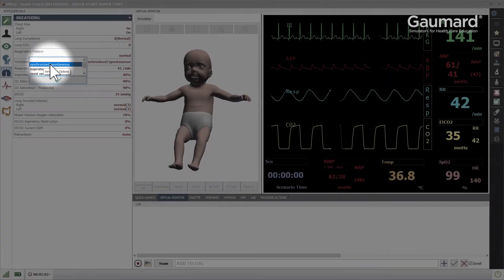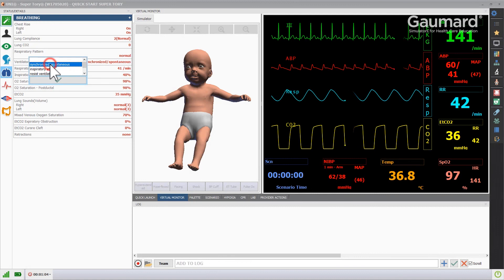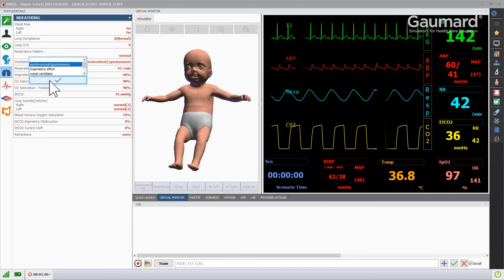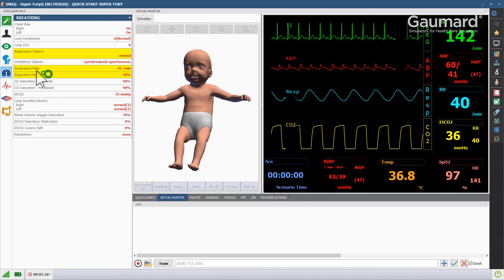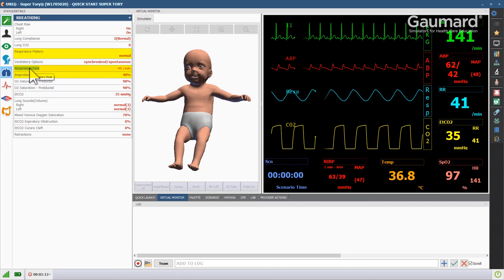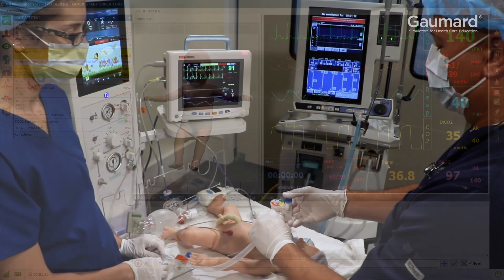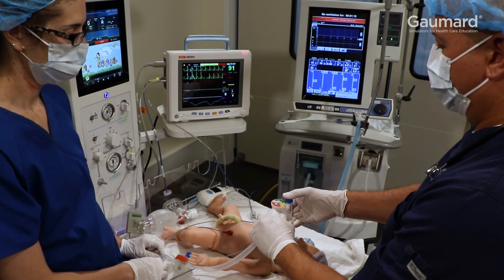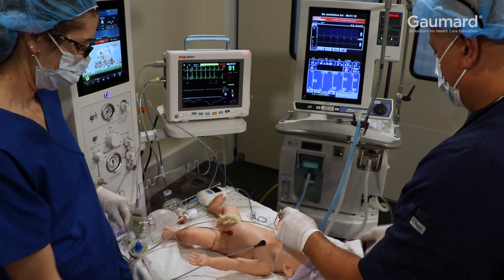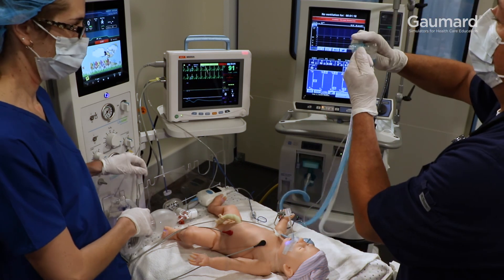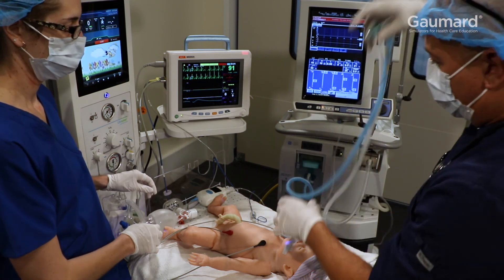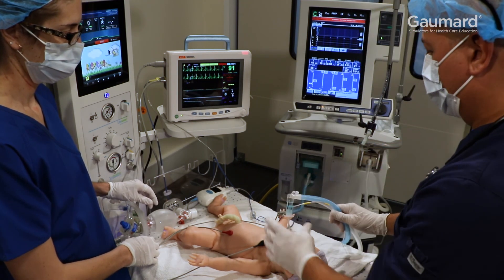When in the synchronized spontaneous setting, SuperTori will take spontaneous breaths as programmed by the respiratory rate, pattern, and inspiratory percent programmed in UNI. The design of the lungs makes connecting to real mechanical ventilators easy without any extra add-ons or proprietary pieces, and allows SuperTori to work with standard modes of ventilation.